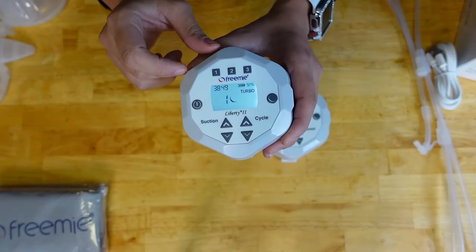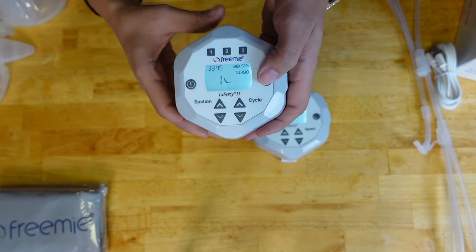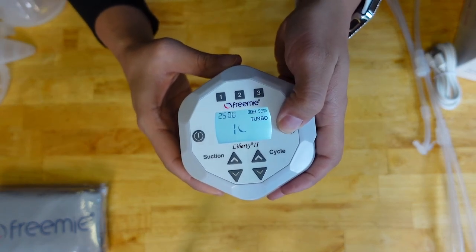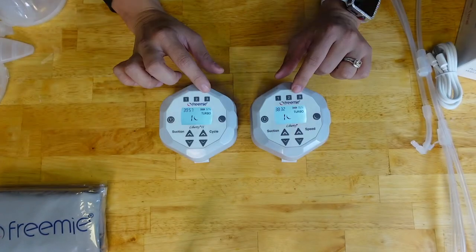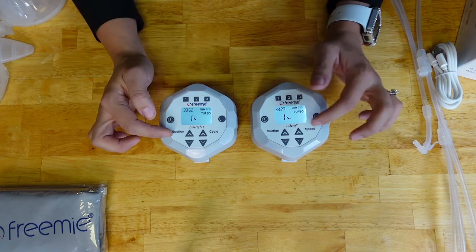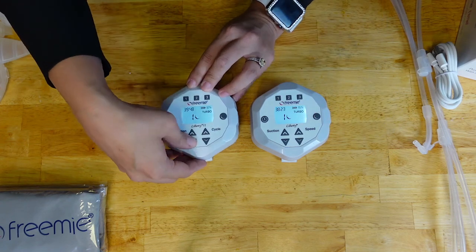On the top is the timer that counts down, or you can set it. It starts at 40 minutes unless programmed differently and goes in increments of 5. The features on the top have stayed the same — memory slots 1, 2, and 3. These are memory features so you can save the suction and cycle settings that you like and simply select them.